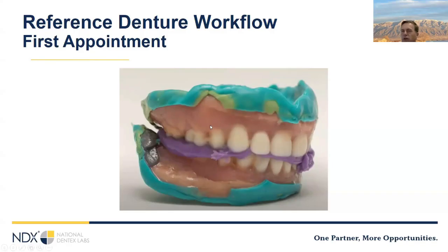Clean all your impression material off, use a little bit of IPA to take off the adhesive, and send the patient home. So that's your first appointment. So far you have one appointment.